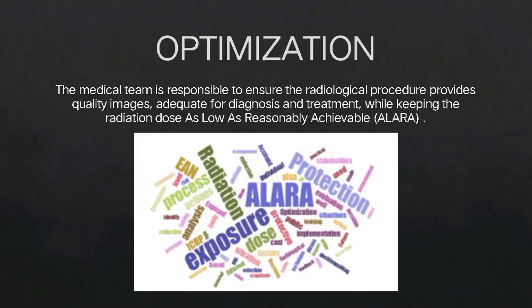The second fundamental principle of radiation protection is optimization. The medical team is responsible to ensure the radiological procedure provides quality images, adequate for diagnosis and treatment, while keeping the radiation dose as low as reasonably achievable.